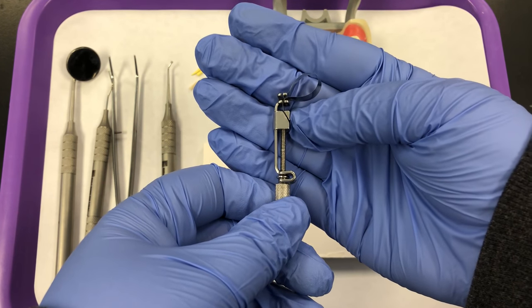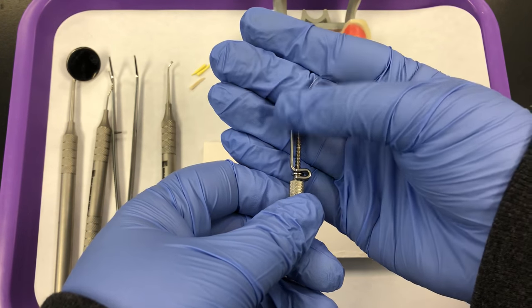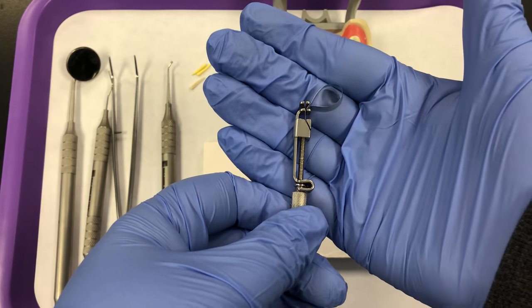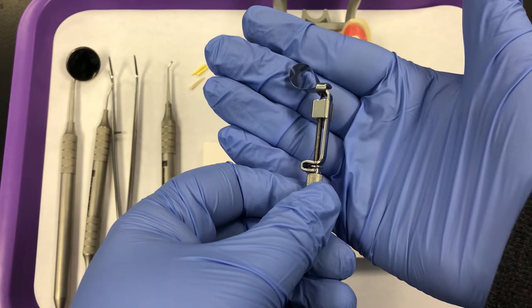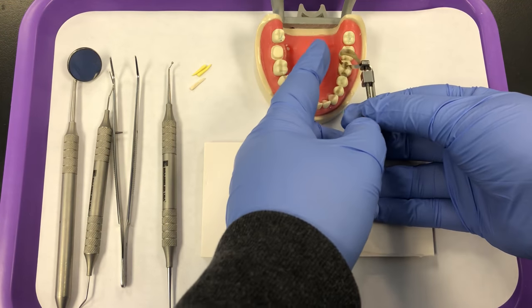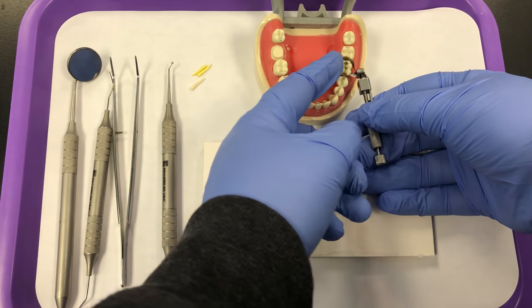Looking at the retainer, I can still see that diagonal slot and the smaller gingival circle. Since this is tooth number 19, we're on the mandible, so this assembly will be flipped over and will go on the tooth with the gingival side facing downward.